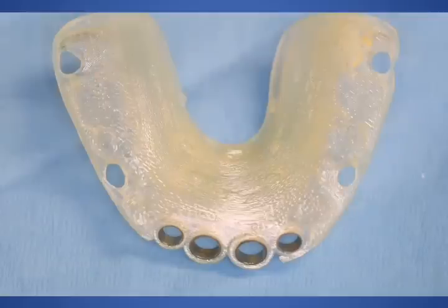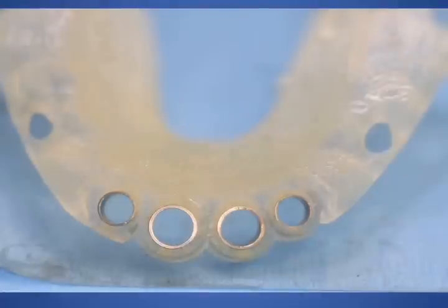Doing the case freehand would obviously create some discrepancy or disharmony and probably would not allow us to load the implants immediately as easily and as predictably as we were able to do in this situation by using a very stable surgical guide. Close-up view of the 4 rings. You can see the separation that will be created from the implants. We have plenty of room to place the implants in the correct position.